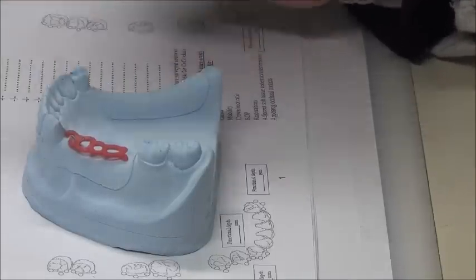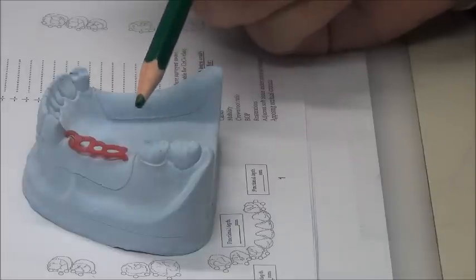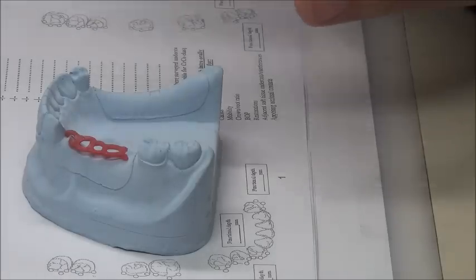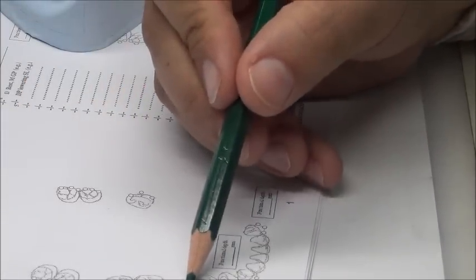If I have a case with limited interocclusal space, for example over-erupted teeth, I need to change to a mesh. But let us keep with the basic design with no rules. Notice that here there are no rules written, meaning everything is suitable. So Akers, open lattice. This is the easiest.